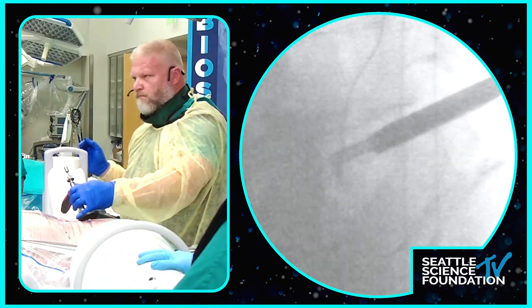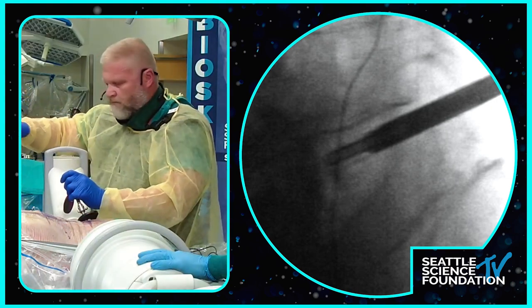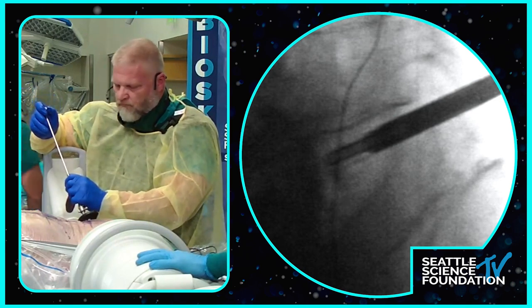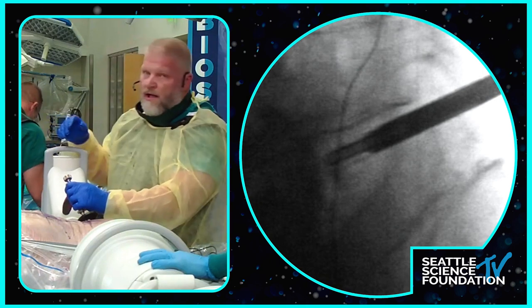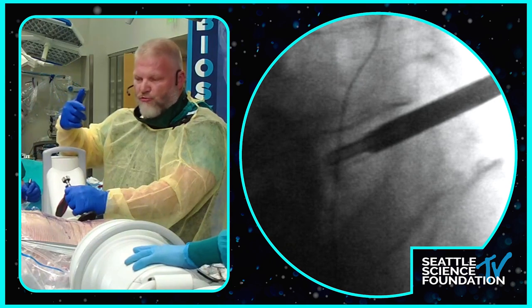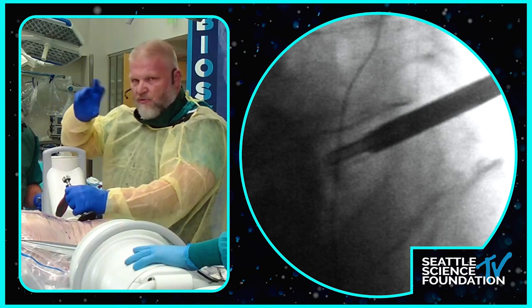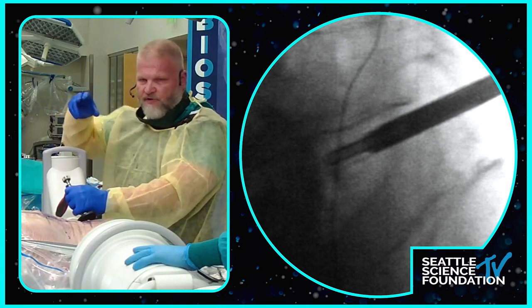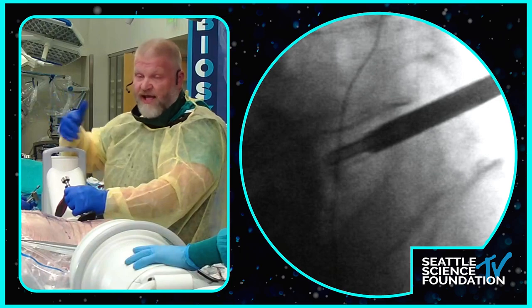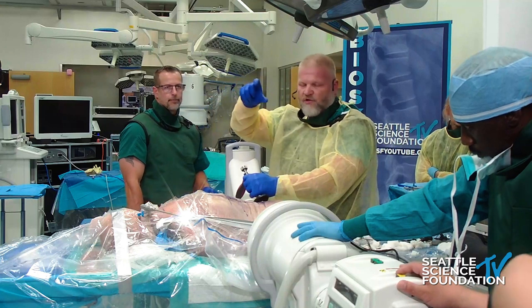Quick question. I'm going to piggyback off of what Chris Young asked earlier. Obviously, fusion isn't just about putting a cage in. I'm struggling to figure out how you do a good end plate preparation with bristles and whatever you just demonstrated. Typically it's under direct visualization the way I do it. There are endoscopic curettes that will back load into the scope. I typically start with an auger, like a drill that you drill across the disc space that creates space. Use the curettes to debulk. The brushes are actually really handy for removing large amounts of loose cartilage. They don't clean the end plate, but they clean the bulk disc material.